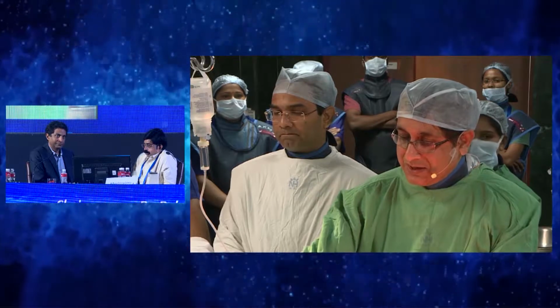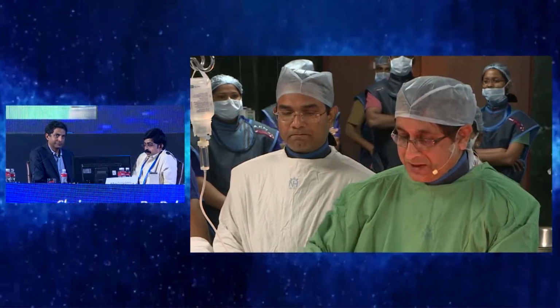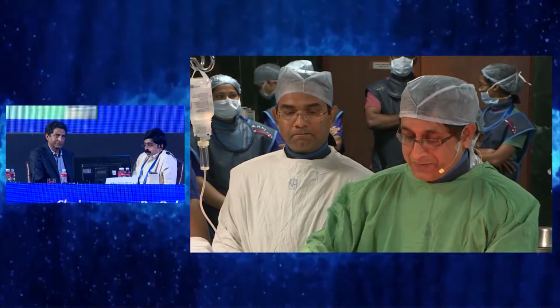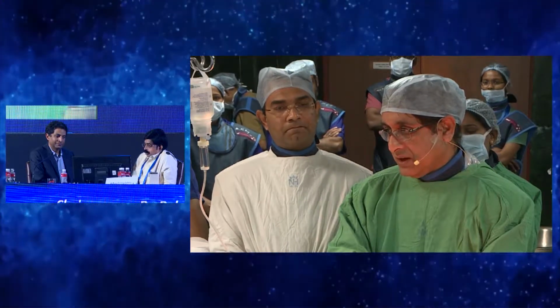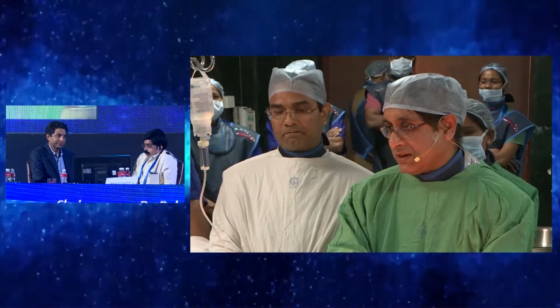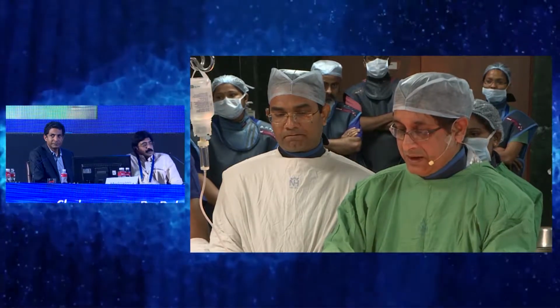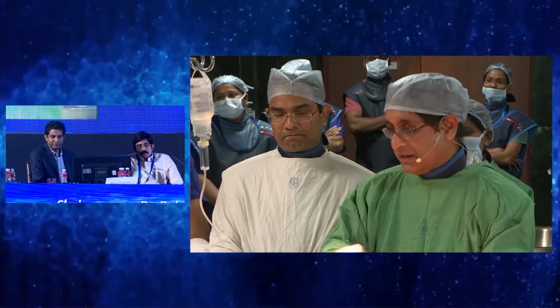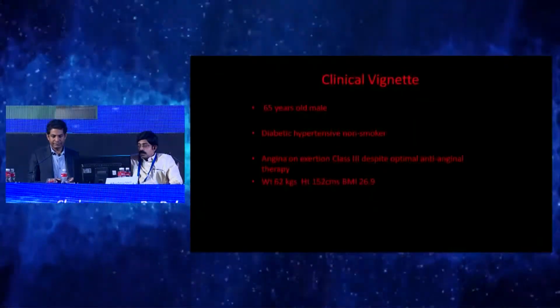So I didn't have in mind to do a CTO, because doing a CTO live is always a little hazardous. But I chose an easy case. I'm going to present the case for you and show you the steps, and maybe we can discuss what we have learned over the years about how to do CTOs and minimize our failures. So can I see the slides?